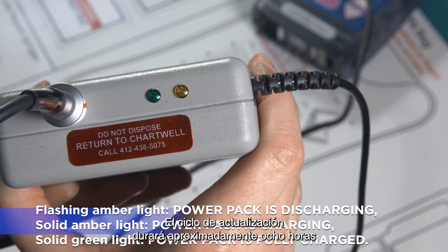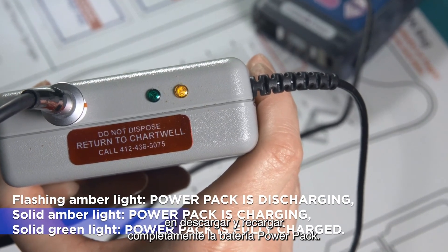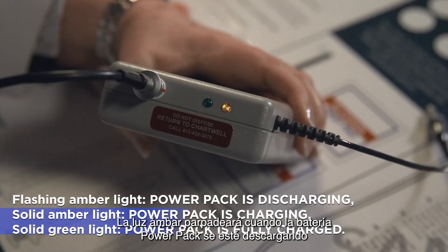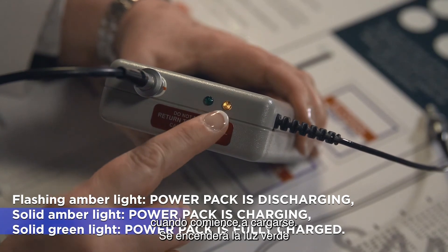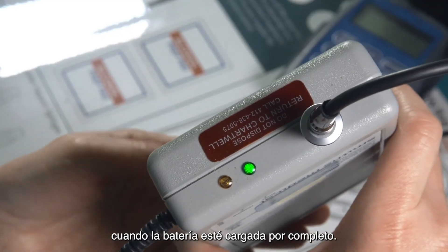The refresh cycle will take approximately 8 hours to completely discharge and recharge the power pack. The amber light will flash when the power pack is discharging and will turn solid amber once the power pack begins to charge. The green light will come on when the power pack is fully charged.